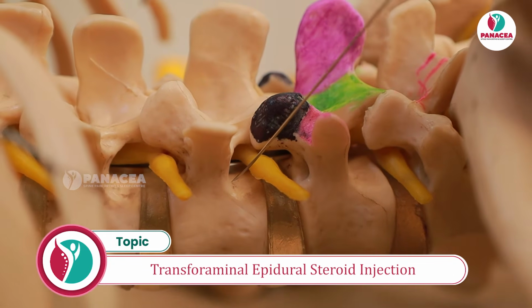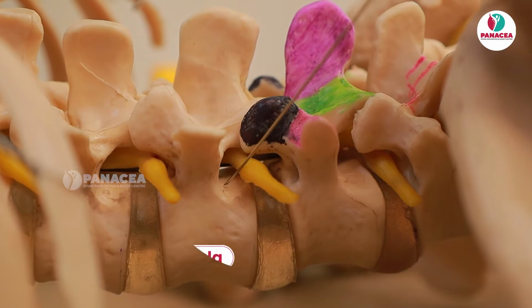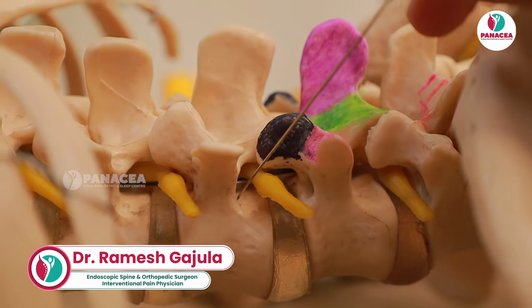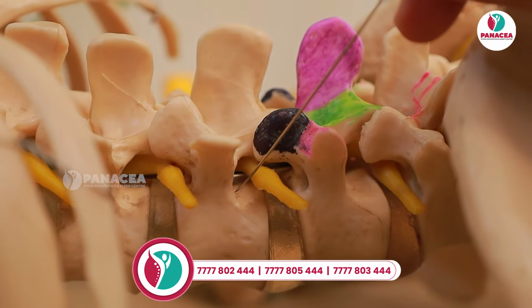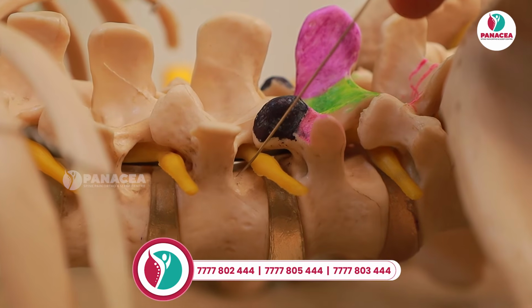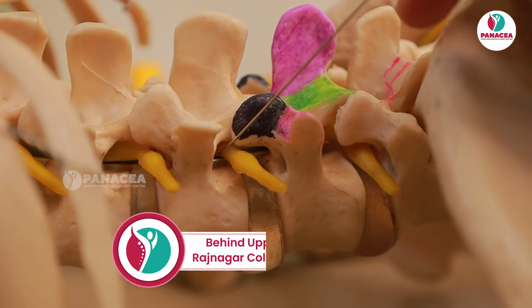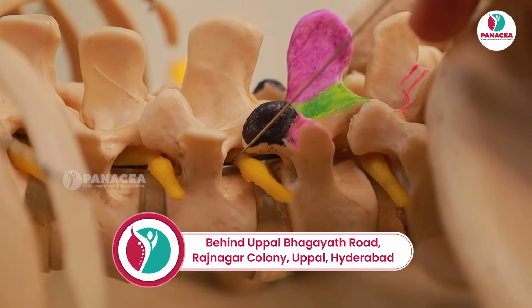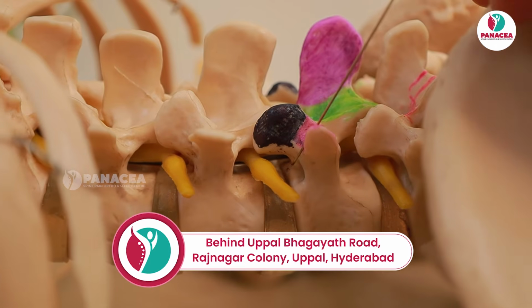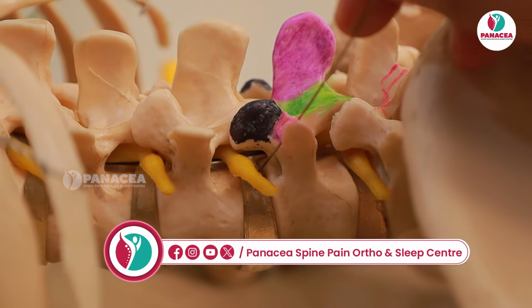This has got only two indications. One is for diagnostic nerve root block, wherein there is a doubt in the diagnosis, the signs are not elicited properly and symptoms are still there. Then for diagnosis purpose we use the subpedicular approach for nerve root blocks, as well as in case of Failed back syndrome, if you want to do a pulsed DRG RF. These are the only two indications, but if you want to do a transforaminal epidural for the sake of the disc herniation, the Kambin's approach is used.